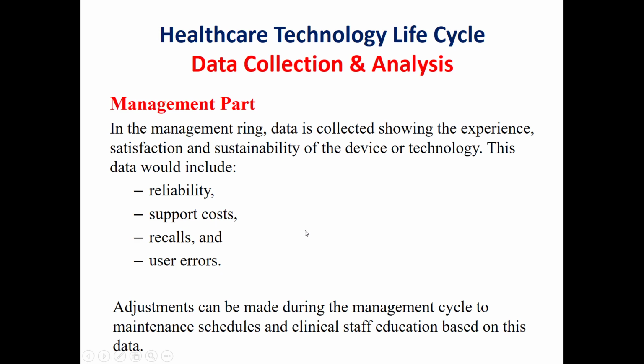Also, data collection and analysis is important and essential in the management branch. This data would include the reliability, the support cost, recalls, and user errors. As we said, recalls or hazard recalls are very important to be taken into account, in order to ensure that our medical devices are safe to use.